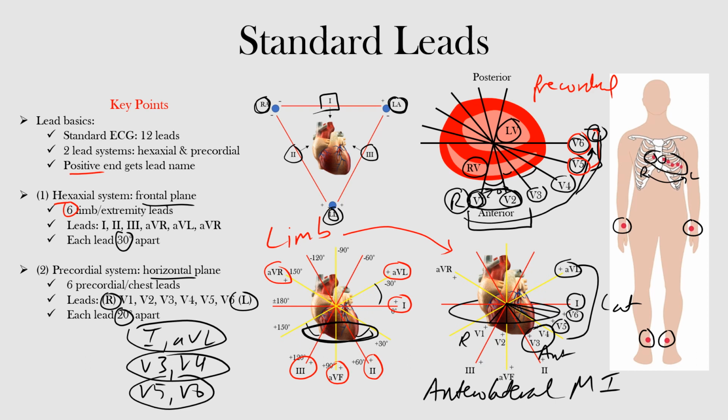Well, that's the end of this lecture. We discussed leads, specifically the 2-lead systems, and how they combine to give us the standard 12 leads on the EKG. I hope you learned something.